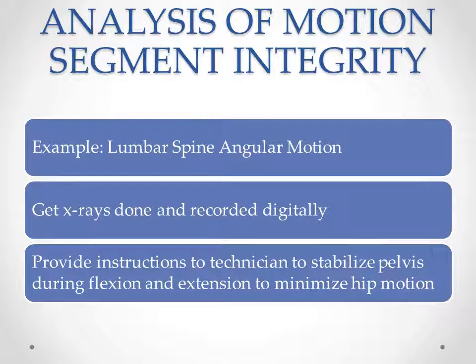If you have an old x-ray machine and sometimes the quality of your images is not ideal, you're going to want to upgrade your images in order to perform accurate analysis of motion segment integrity. And it's worth sending the injured worker out to a local imaging facility. And remember that the whole philosophy of this program is to increase the persuasion power of your reports.